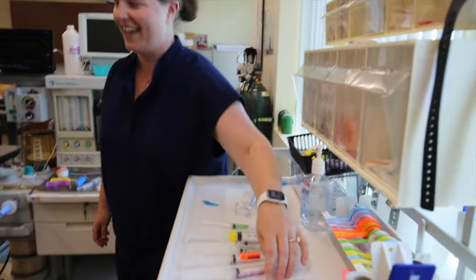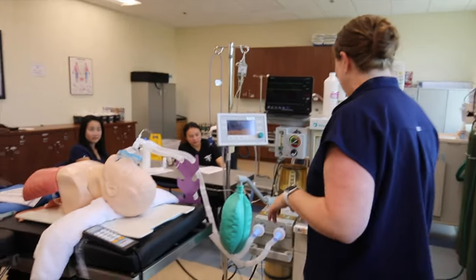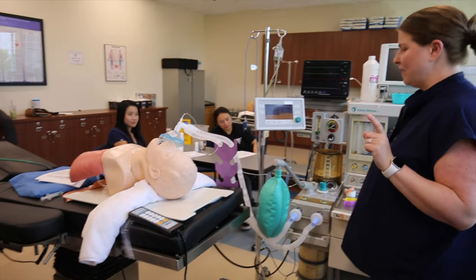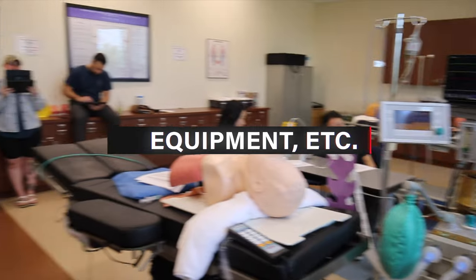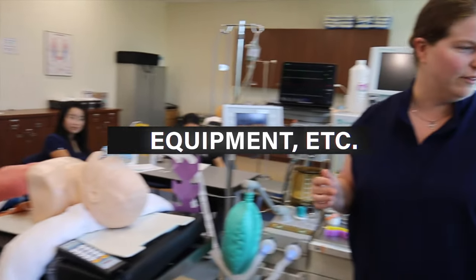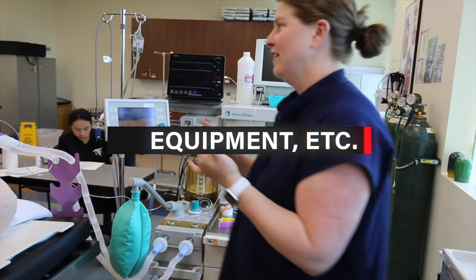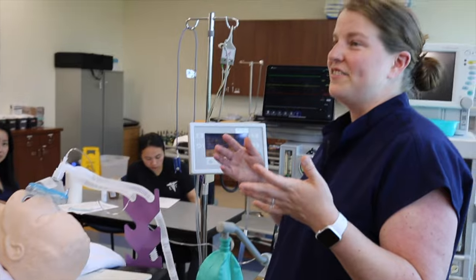Then your sux and epi. The epi should be 10 mics per mil. All right. So that was D. And then E is everything else. This is our lazy umbrella catch-all for everything else that's not covered under the rest of SAMMTIDE. So that would be your Bair Hugger, your peripheral nerve stimulator, and then case-dependent other things.